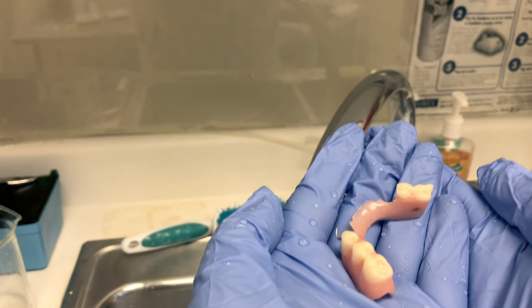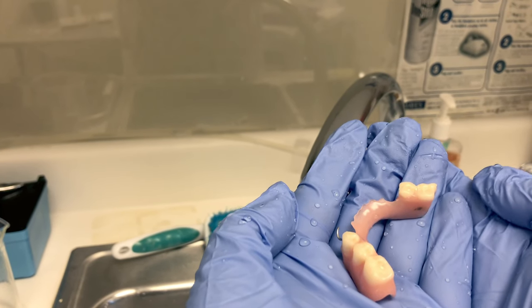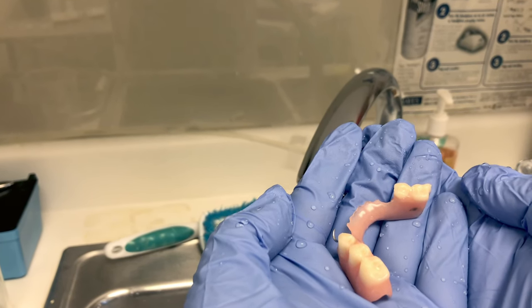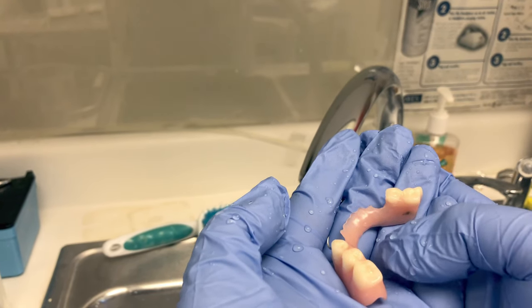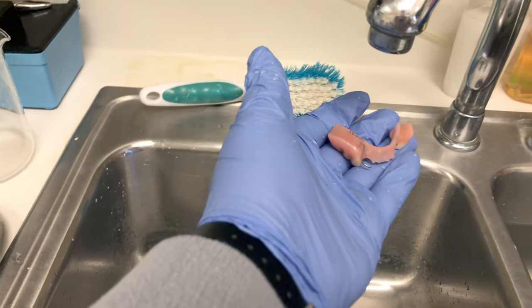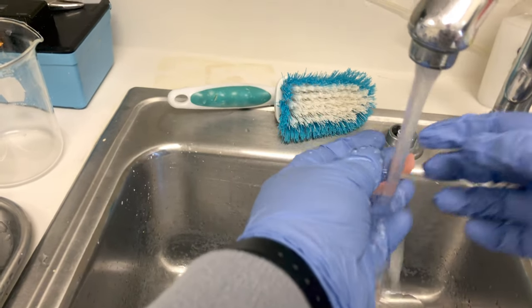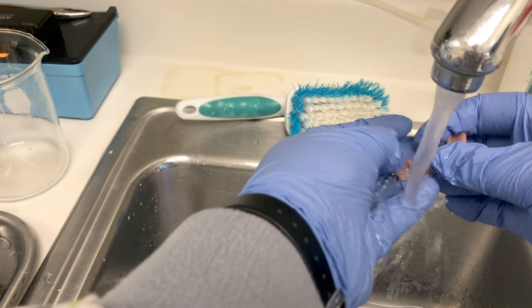First thing we do: take the item from the patient with gloved hands. This appliance just came out of the patient's mouth, so make sure you're wearing gloves. Then bring it into sterilization and give it a good rinse under the faucet. This will help remove any bulky debris from the appliance such as food particles.